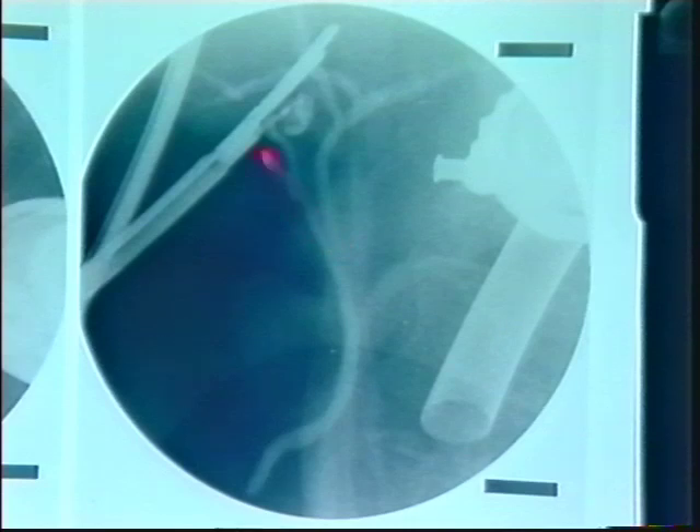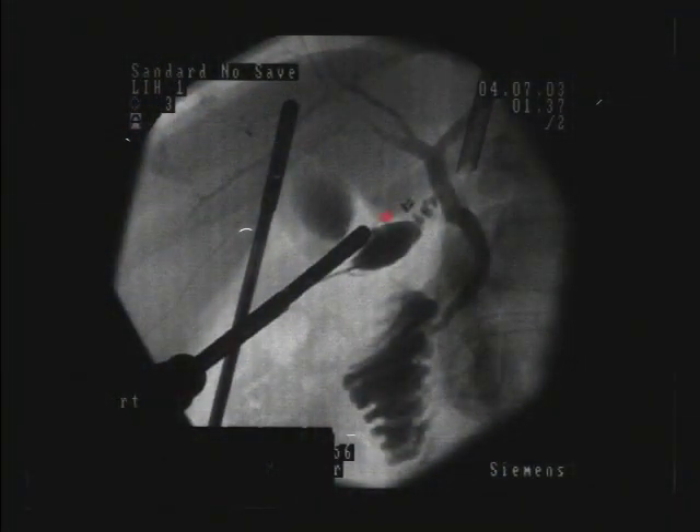This is a typical cholangiogram obtained using the Kumar clamp. The clamp, the Hartman's pouch with a stone, and the injecting needle are clearly seen. The cystic duct is extremely narrow and its length can be evaluated. In this cholangiogram, clips applied to the cystic artery are visible, serving as a valuable reference point that tells the surgeon they are working in the area of the cystic duct and not the common bile duct.